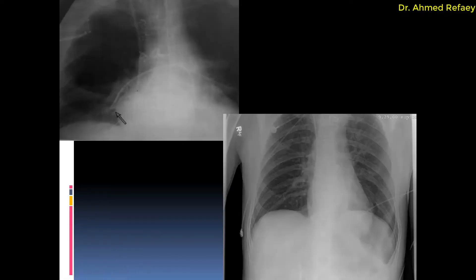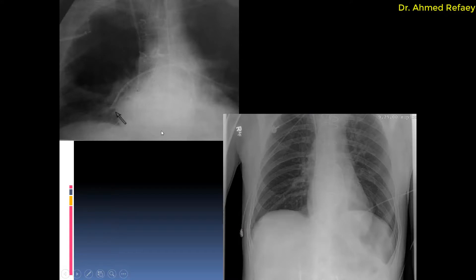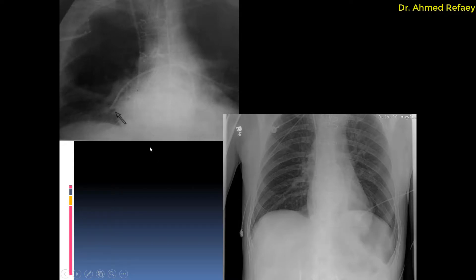This is a comparison between correct and incorrect placement: the tip should be in the proximal part of the artery, while this malpositioned example shows the tip in the distal part of the artery.